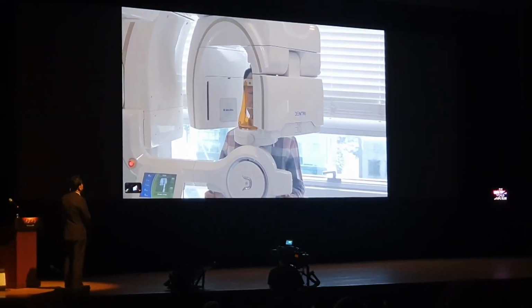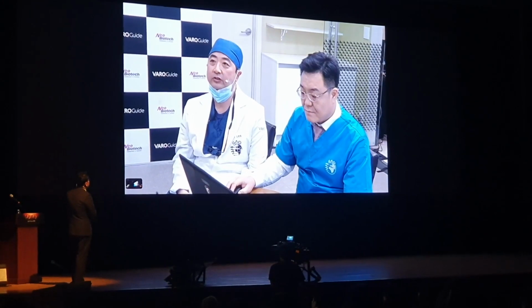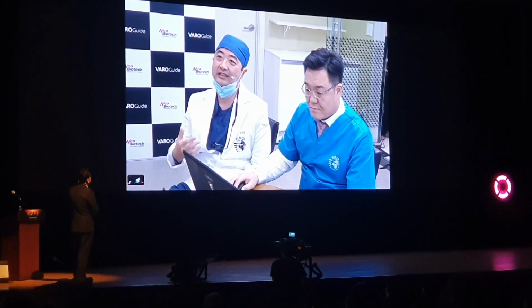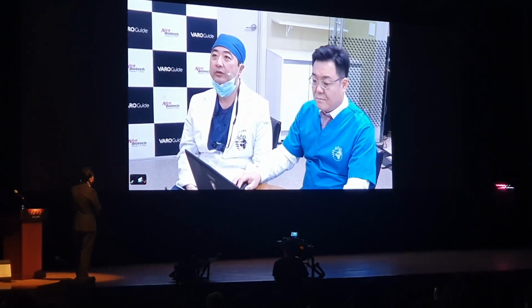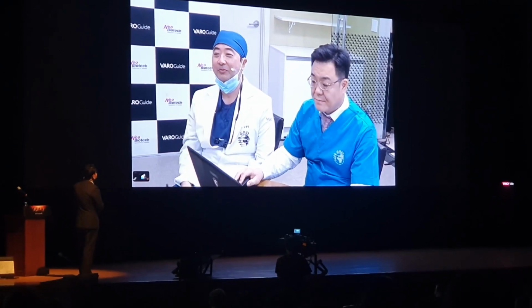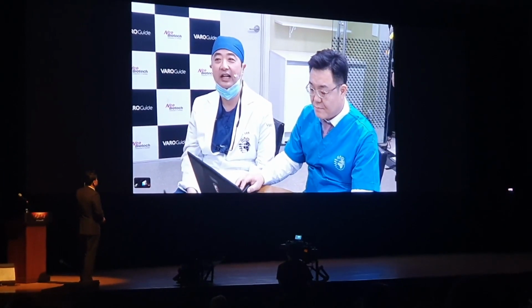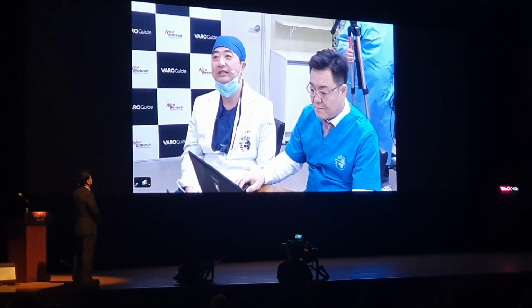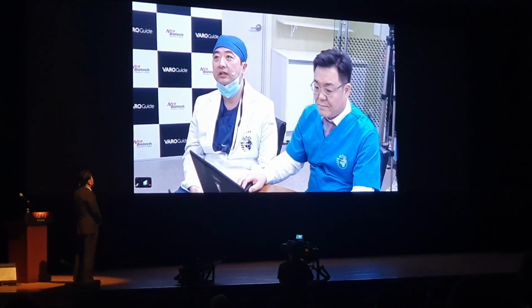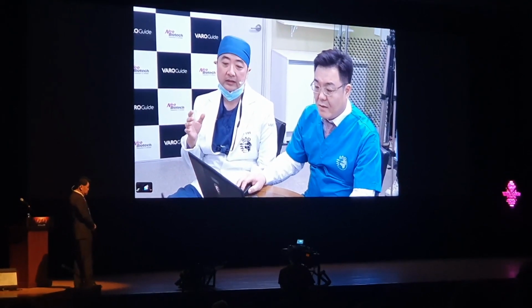So while the guide is being milled, I'll put Dr. Ho under local anesthesia. And as a patient is here with us today, I'll discuss with the patient and plan together. As with many other software, it takes time to adapt to the system, perhaps about a month. So the more we use it, the faster it gets and the more skilled we become. At first, it'll take a while, but once we get used to it, I'm sure we'll do just perfect.